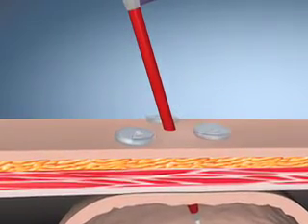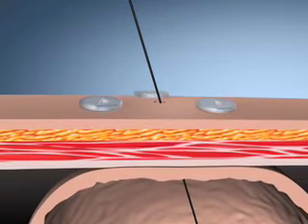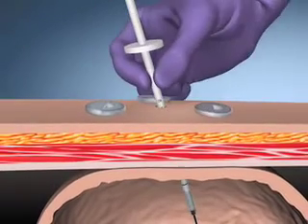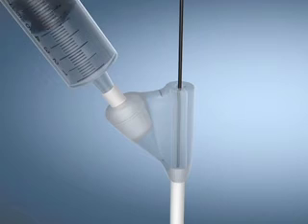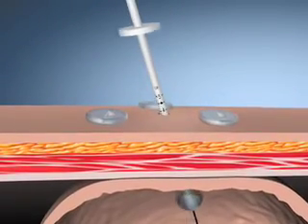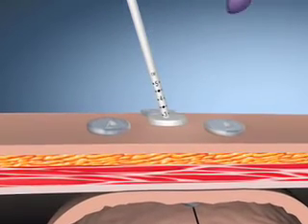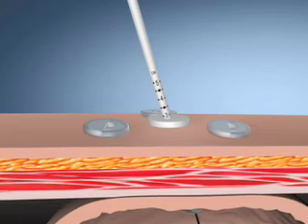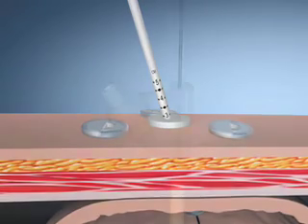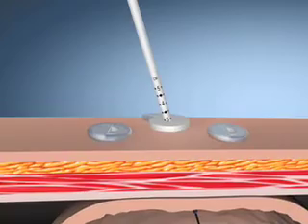Moisten the tip of the stoma measuring device with water-soluble lubricant. Remove the dilator, leaving the guide wire in place and place on a clean surface. Advance the stoma measuring device over the guide wire, through the stoma tract and into the stomach. Fill the luer slip syringe with 5 milliliters of sterile or distilled water and attach to the balloon port. Inflate the balloon. Pull the device toward the abdomen until the balloon rests against the inside of the stomach wall. Slide the plastic disc down to the abdomen and record the measurement proximal to the disc. Add an additional 4 to 5 millimeters to the measured shaft length to ensure a proper fit post tube placement. Record the final measurement. Remove the water in the balloon and the stoma measuring device, leaving the guide wire in place.